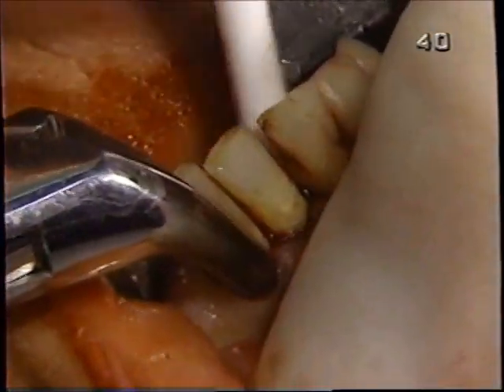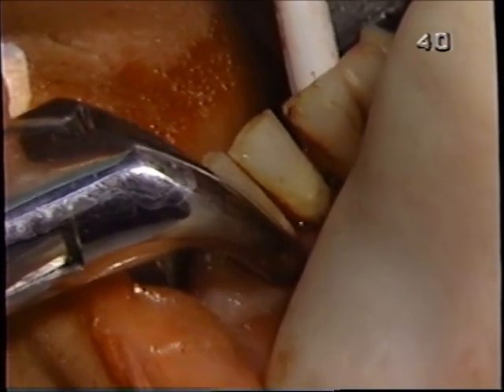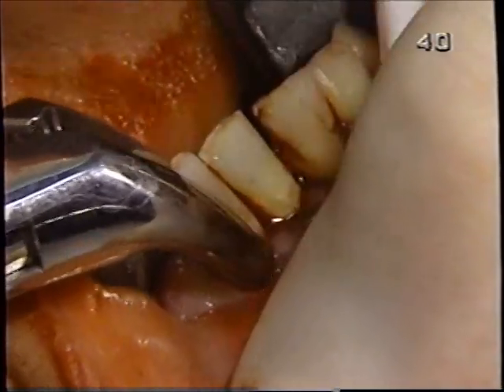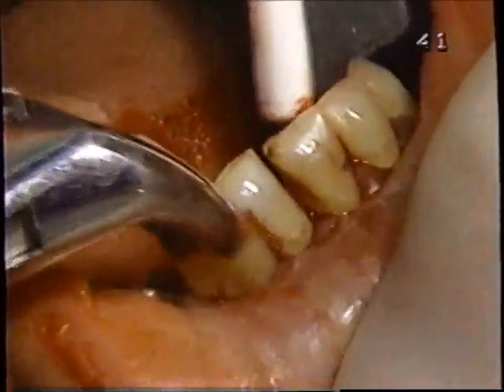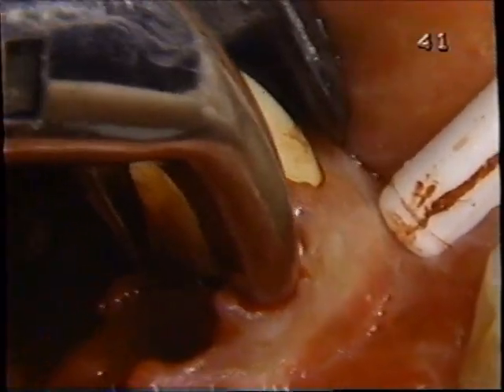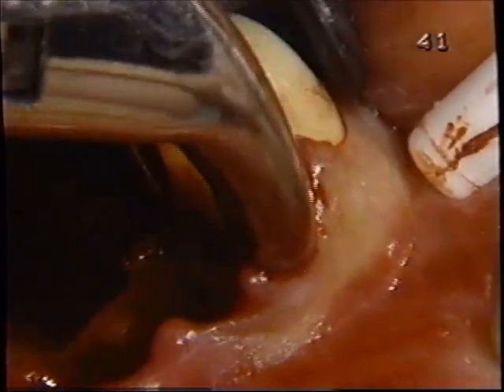Okay, so buccal, lingual, buccal, lingual, apical as well, if you like. Some rotational. Another principle we want to try to remember is to have your forces and forceps in the long axis of the root.